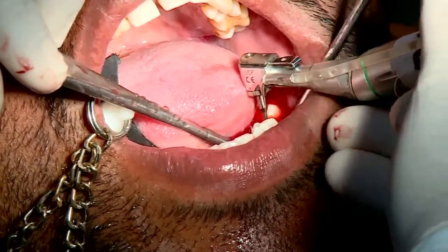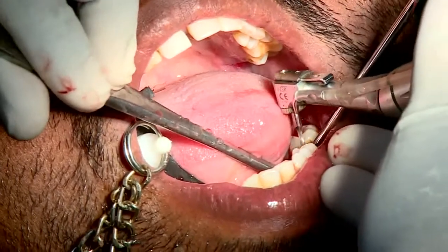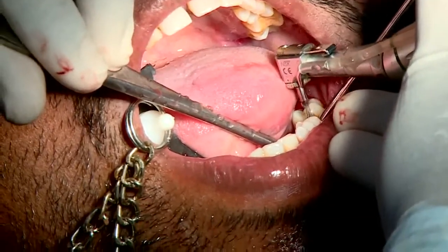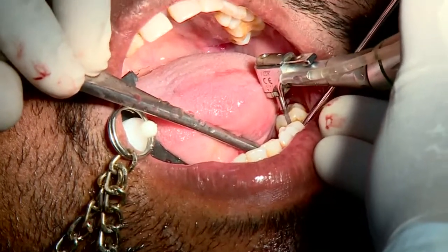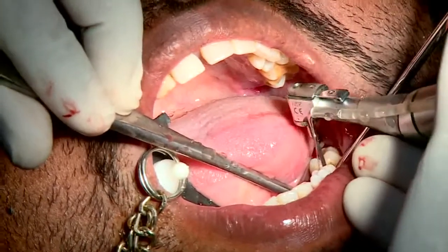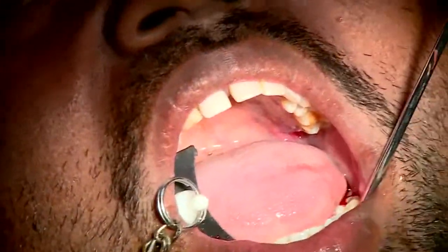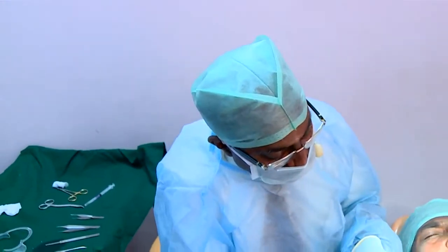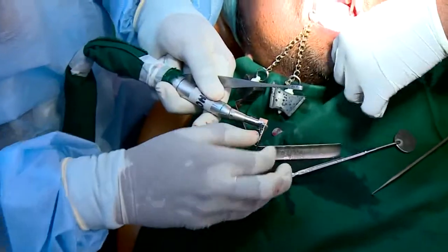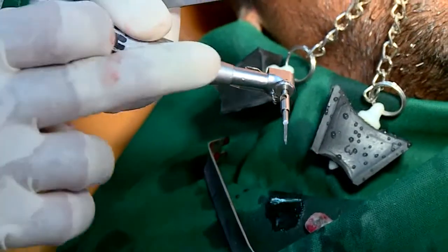Am I blocking the way, or are you guys able to see it? Actually, the site is not visible, sir. Only we can see the drills, but we can't see the site of preparation of your drill. Okay, I'll see whether I can do it a little bit. Just one minute. Now I have made another attachment. All I need to do is slot it in. This one will just slot inside. So my drill is now extended.